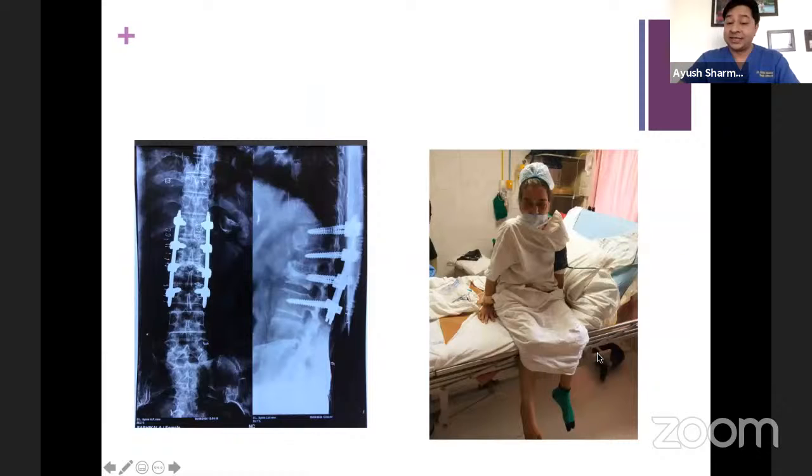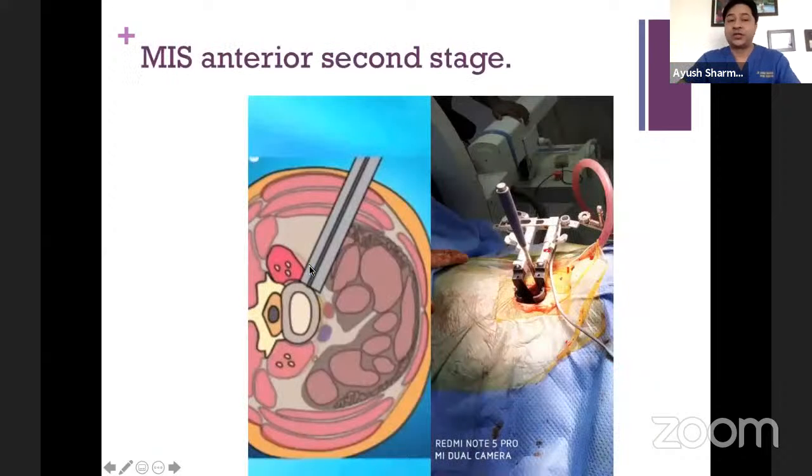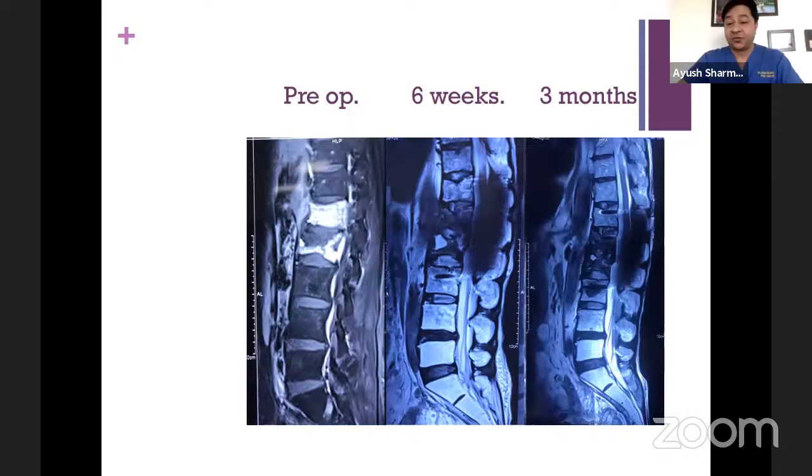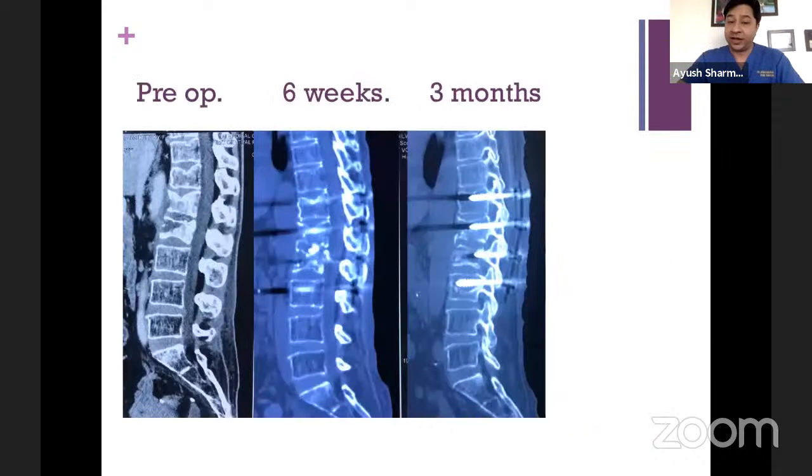We could mobilize her within a few days, and at least the bed sore and everything got better. And this is what we had post-operatively. You can see how we have filled the whole thing. Fortunately for us, the plan was to do, if needed, a second stage anterior. This is the follow-up. This is the pre-op, this is 6 weeks under antibiotics, and now we have 3 months follow-up, and she has been holding well.